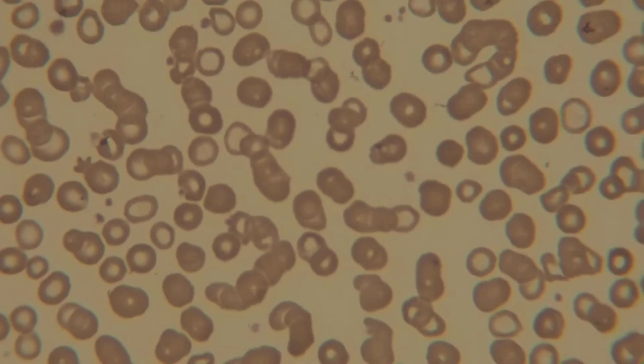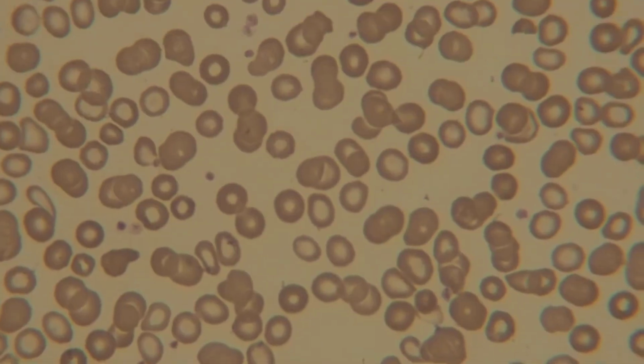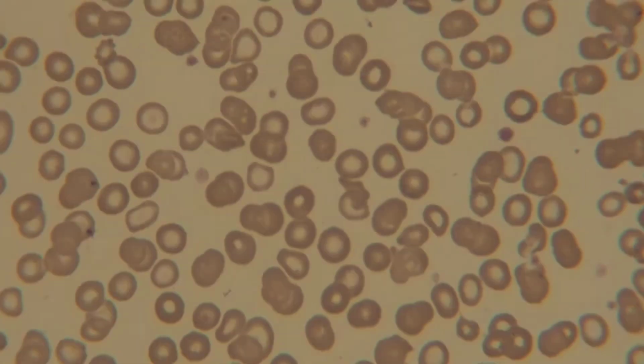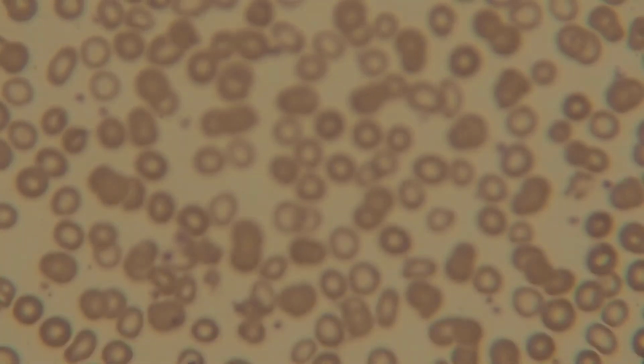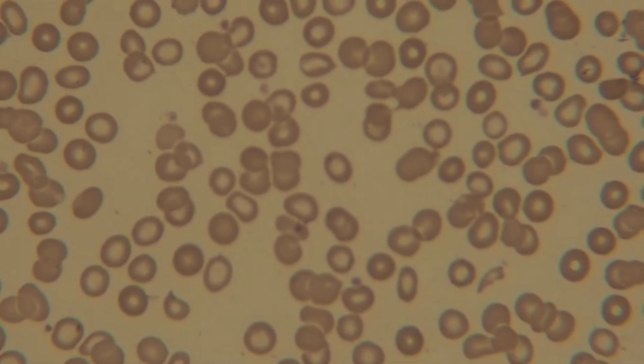Lymphocyte. Always trying to look into the area that's less dense. You don't want to do your manual differential in an area that's very dense, because the quality of the cells is not going to be very good.